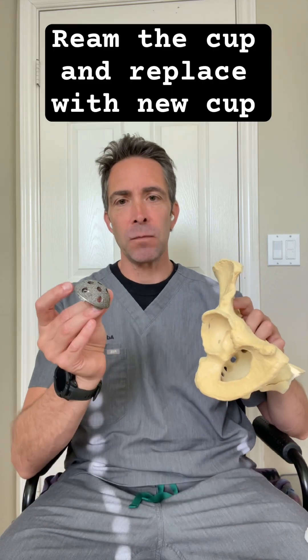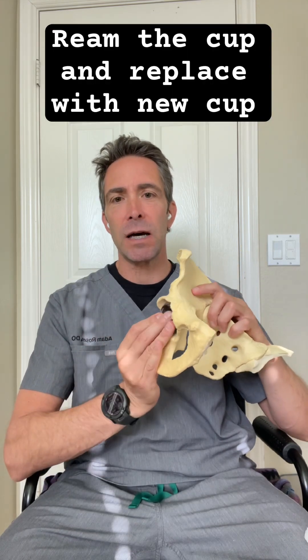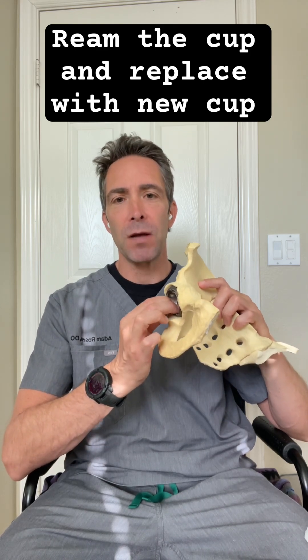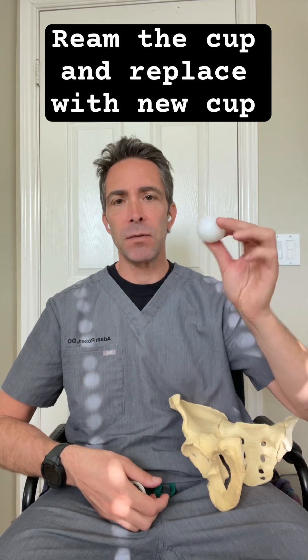And then there's a metal shell, which is mostly made of titanium, but it's porous. It gets placed inside your cup, and the bone will grow into that. And then inside that metal shell goes a liner, typically made of plastic — other options are ceramic, and previously people used to use metal liners.